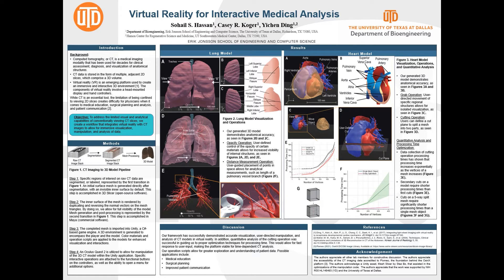We also have a distance measuring operation, seen in Figure 2F, where we measure the length of a vessel branch. The view of the heart model in Figure 3A, side by side with 3B, shows that our heart model is also anatomically accurate, since we are able to see the ventricles, atria, and vasculature. Figure 3C demonstrates our grabbing operation, where we are able to move a regional segment of the model — in this case the pericardium — to increase visibility of the inner structures. We also perform cuts on the model with a user-defined plane, seen in Figure 3D.